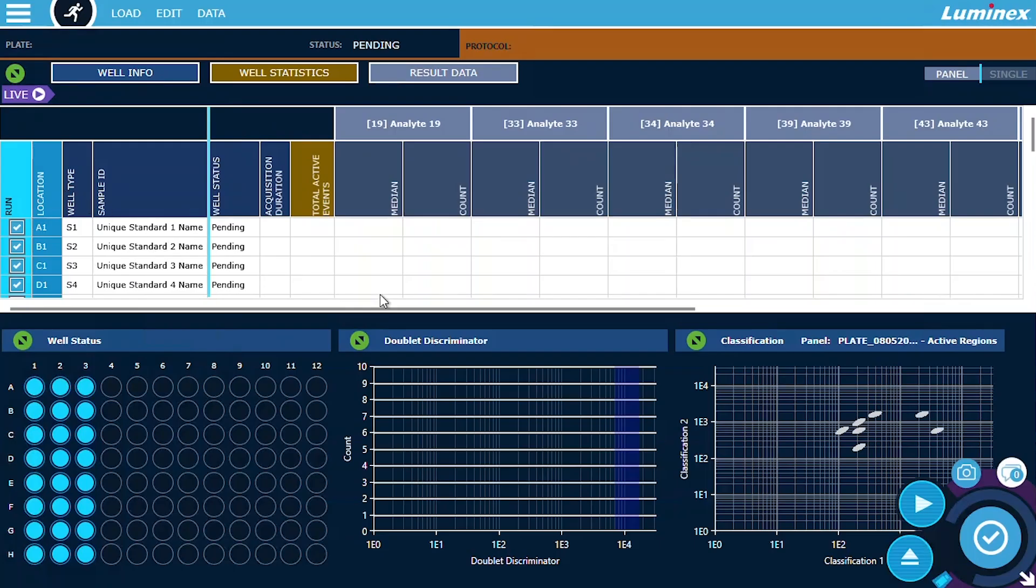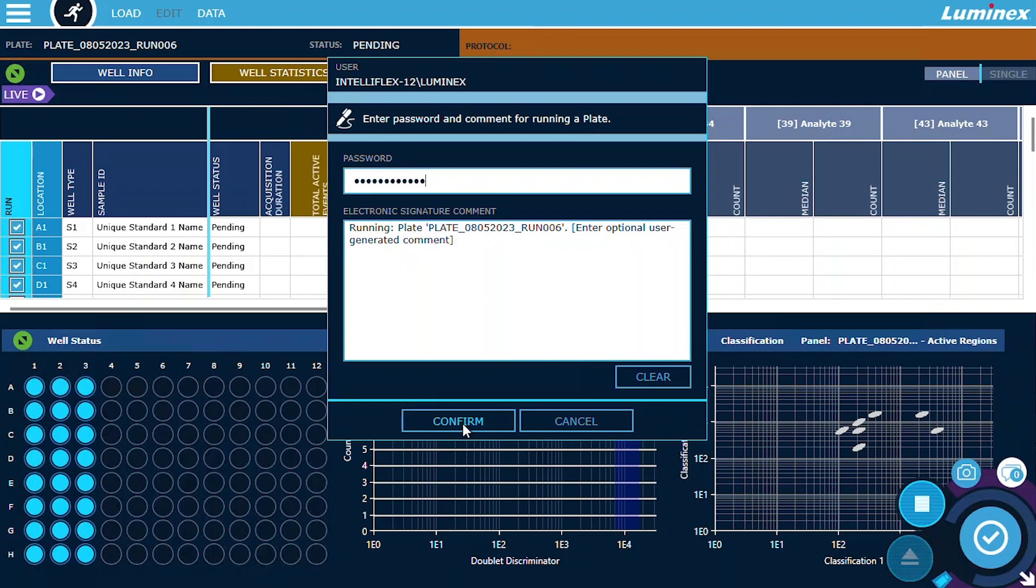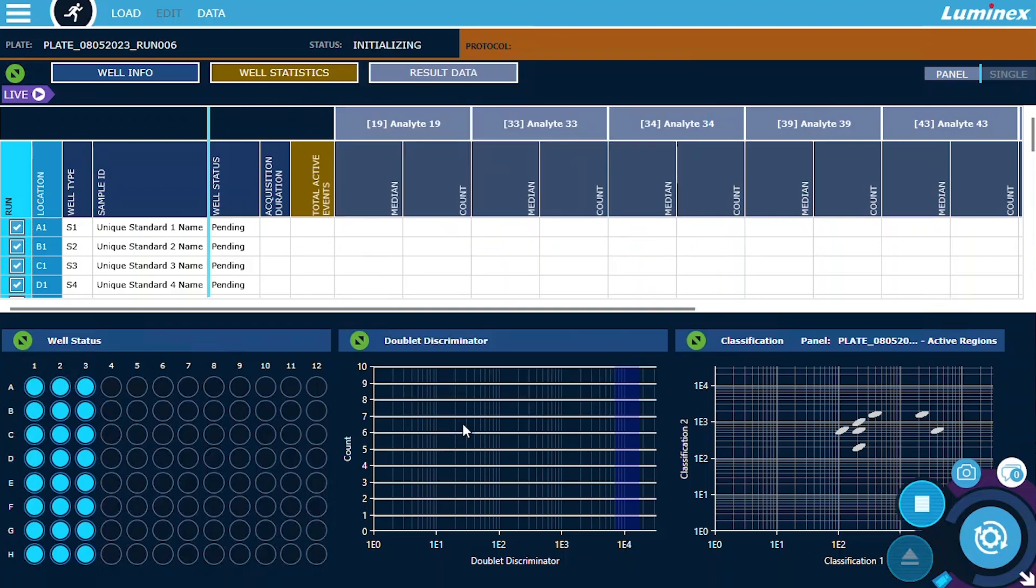Signatures are stored on the device with the event they accompany and can be reviewed via the instrument system log or IntelliFlex XLS report. The electronic signatures prompt includes a standard message for each signing event and allows users to enter free text comments as well.